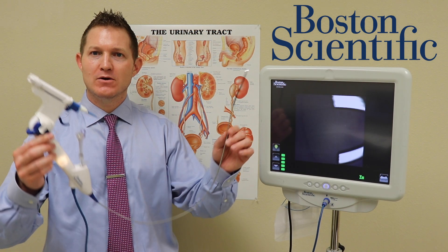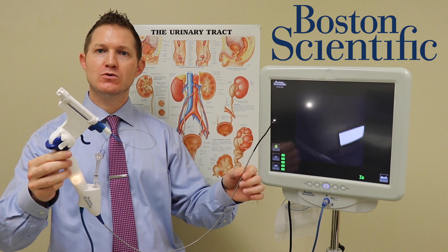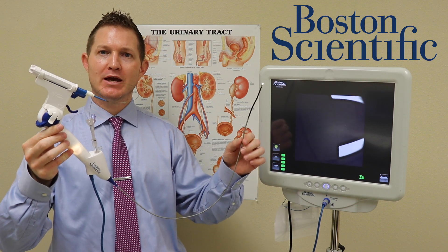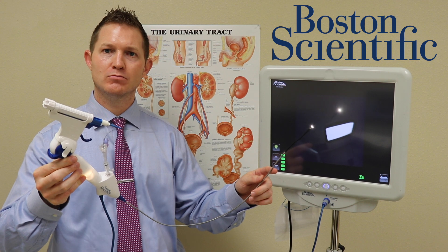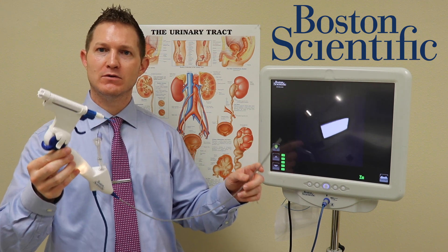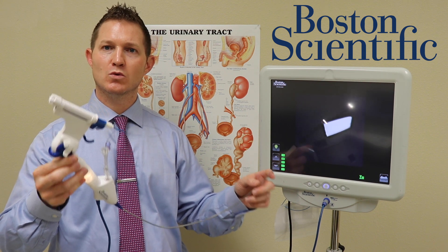We're talking about LithoVue, we're talking about Empower, we're talking about kidney stones — we're talking about the surgeon's ability to see and efficiently get through your surgery and get you back to recovery, awake, out of anesthesia, and feeling comfortable and resolving your issues with kidney stones as quickly as possible.